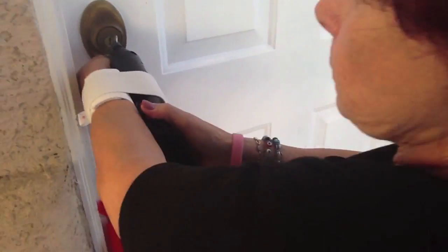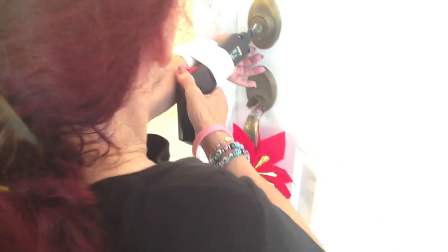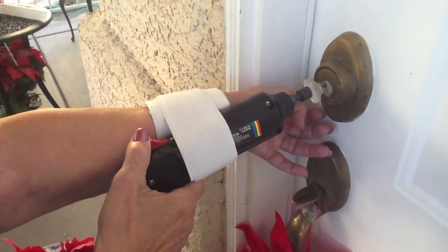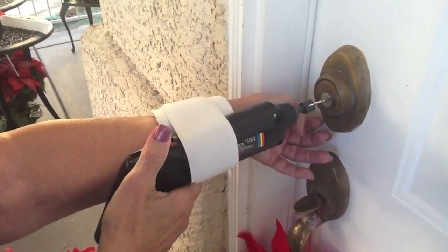We hope you enjoy it, and here's a clip of us using it. This is the device that we are going to be testing. Maggie, can you please pulse it forward. Now can you please pulse it backwards.